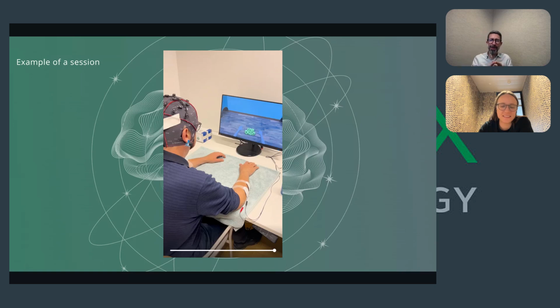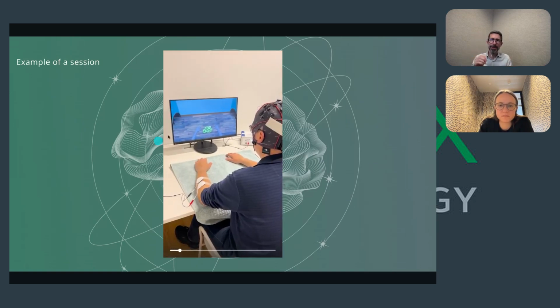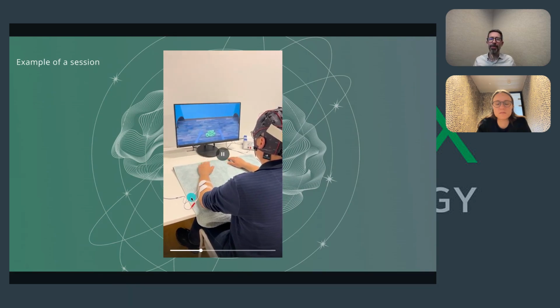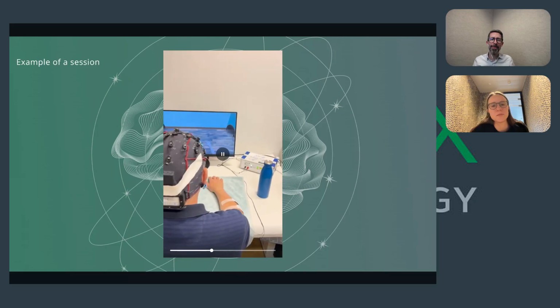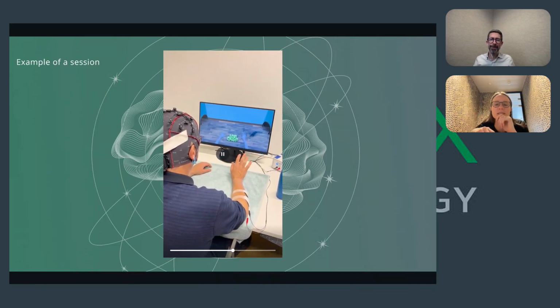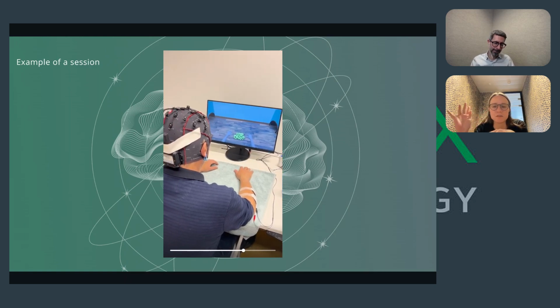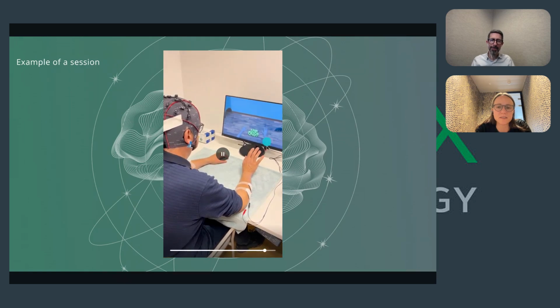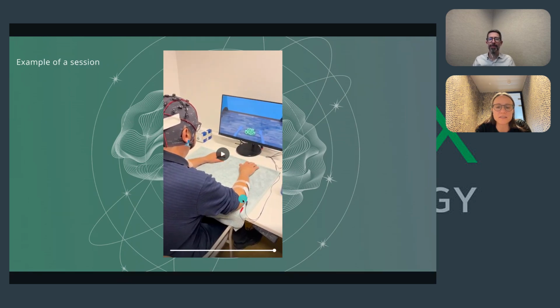So there was what the imagination part does. Then there was what you see on the screen. So there's movement as a reward for what your brain has just been doing, and the electrical part where the arm is actually moving up. You don't have the sound here, but there is a verbal cue that says left or right, and so the person is imagining the movement of the affected hand, and once he does that, the virtual avatar moves and he gets the stimulation here, and it's the stimulation that makes his arm move, but you can hear it. It makes a little noise.